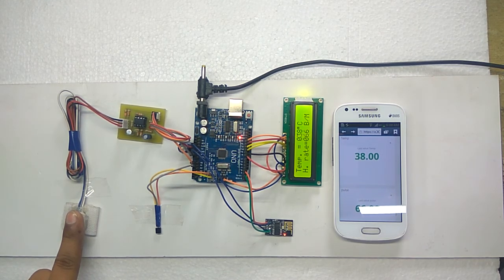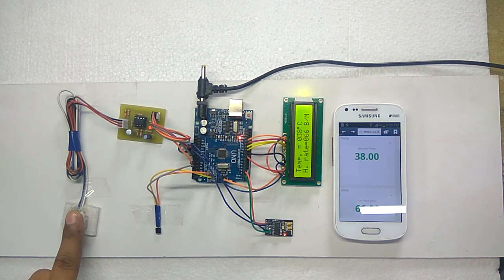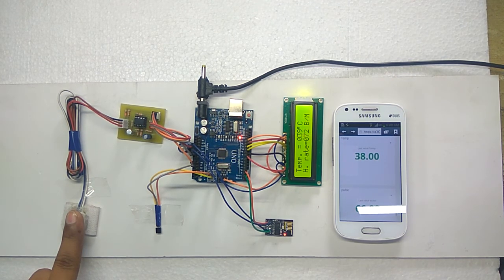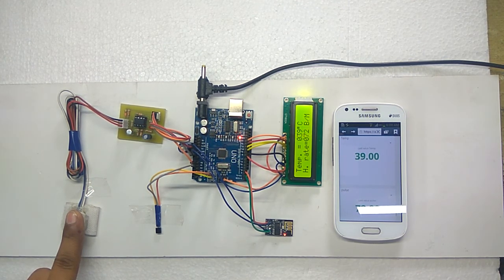Also, it reads the temperature and displays on the LCD. Same data it will send to UBIDOTS through WiFi module over the internet.